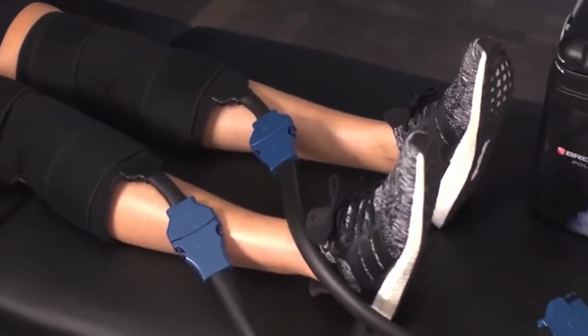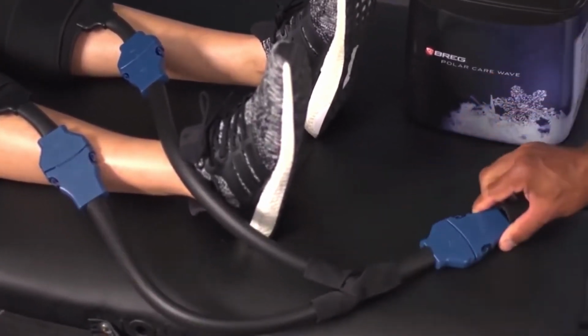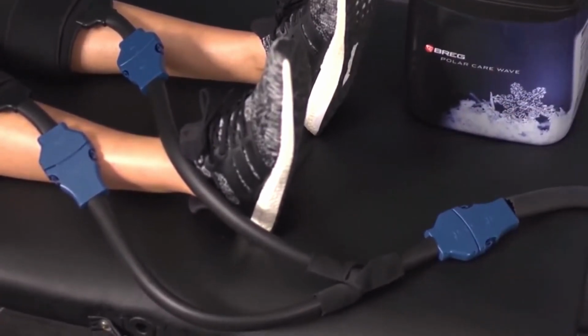If you are hooking up 2 knee pads to the same container, you will need the knee Y adapter accessory, which is sold separately. Please note, the knee Y adapter is designed to be used with BREG knee cold compression pads only.